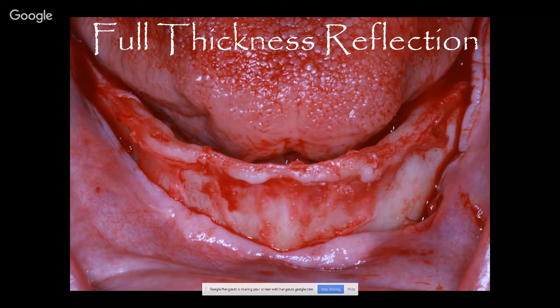I'll go down, measure, go back to my CT scan, come back and forth and back and forth. So going from the spine, I'll move across, go 12 millimeters, poke a hole, back from the spine, going back and forth with my image. Here's the mental nerve, and I'll traverse back and forth. It's difficult to do, but if you're going back and forth from the CT scan, and I keep it behind the patient, I'm able to plot out how much bone we need to remove.